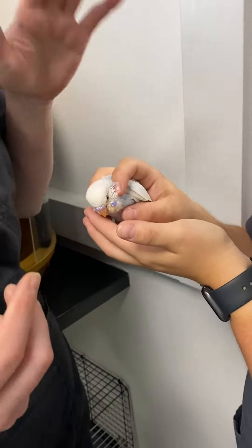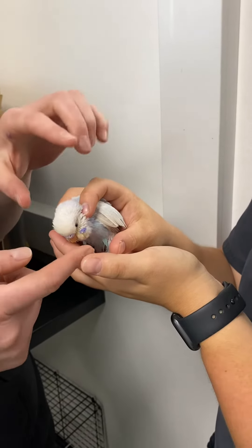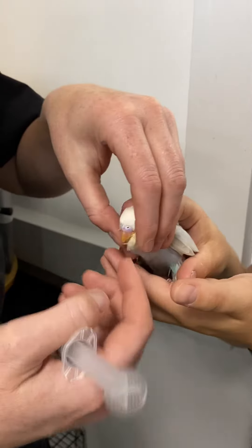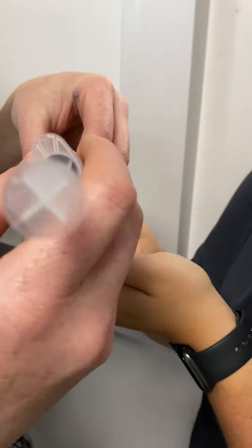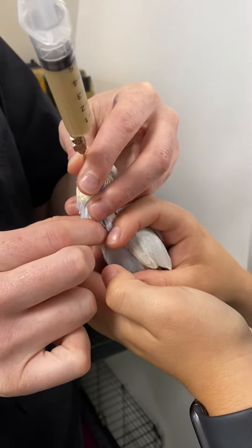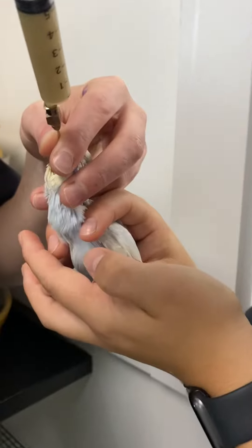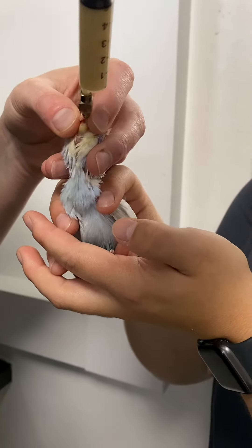I'm probably not going to give all of this to this little guy. Ali is here holding him nice and still — you want his feet nice and stable, with fingers either side of the head. I'm going to pop the tube in on one side of the mouth and down the opposite side into the crop. I'm holding it in place with one hand and I can feel his trachea separate to the tube, so I know I'm in the right place.